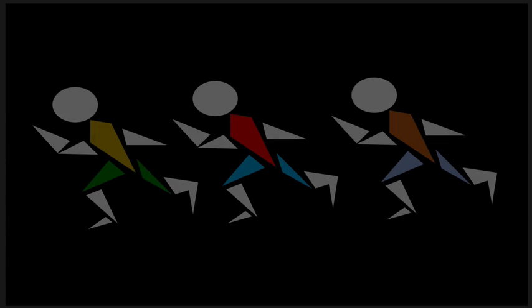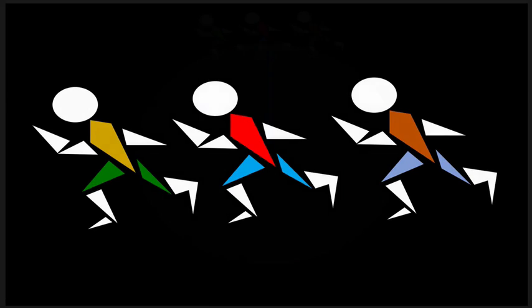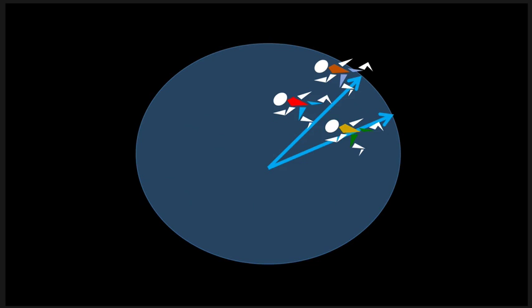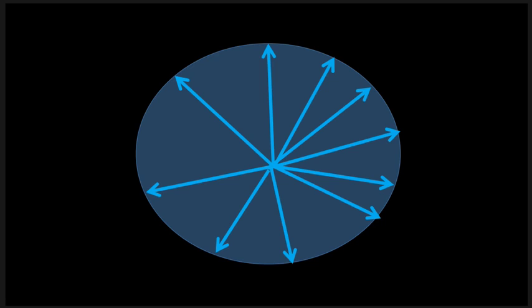Now, if you've got three different guys from three different teams and backgrounds, etc., and they all start on the starting line together, they're going to separate out from each other really fast. So the point of this is to help you remember that things that are heterogeneous are going to lose that T2 signal faster than things that are homogeneous.